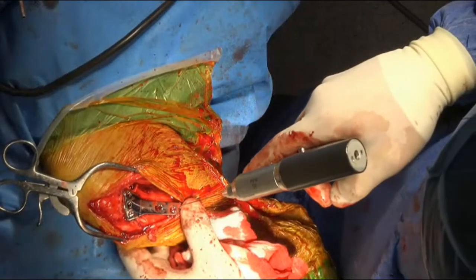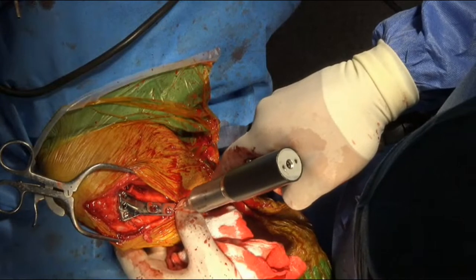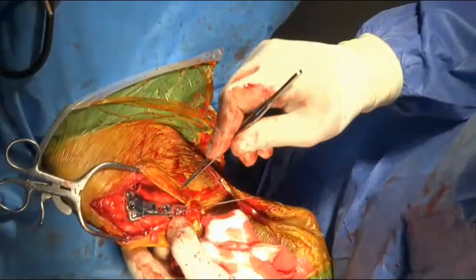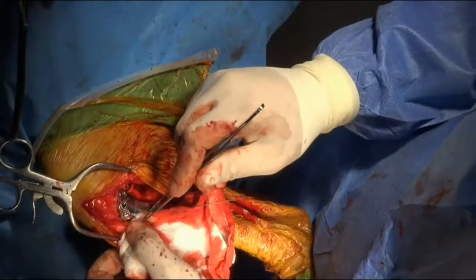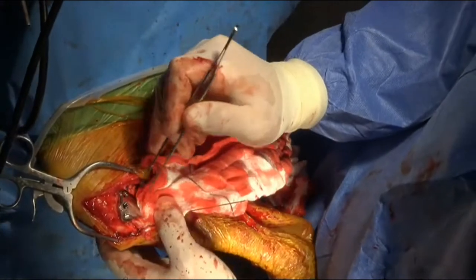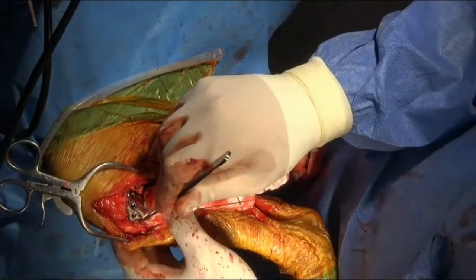Thank you. So these new plates are really nice where they've got these pinholes in here. So we can put these pins in, keep the plate on the bone, and just triple check our alignment with everything, make sure it all looks good. It takes the guesswork out of surprises when you think everything's looking good, and then you go to put the last screw in and you realize you're not sitting over the bone as well as you'd hoped. So I think it's a great development in the system.